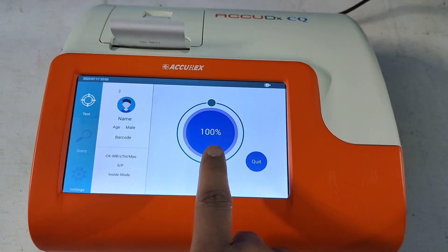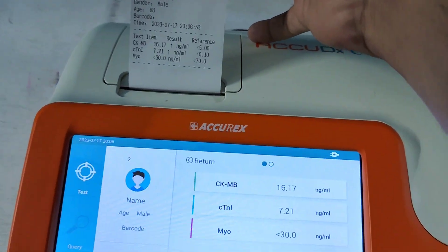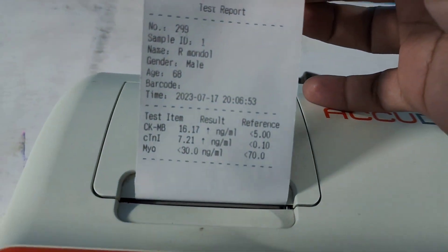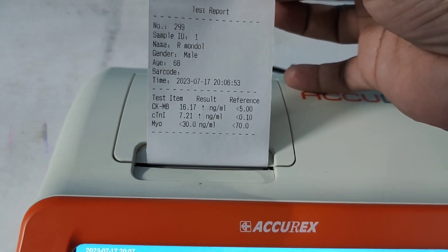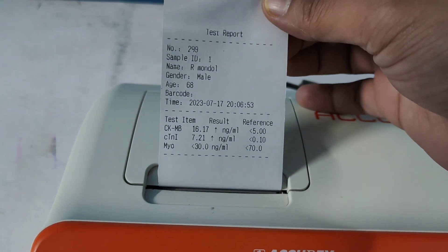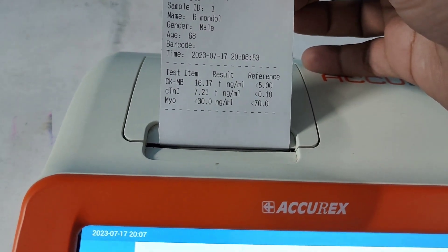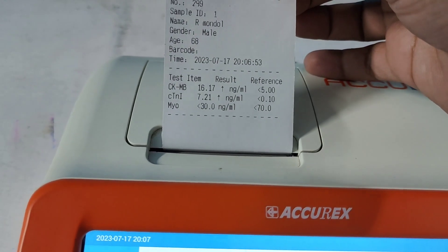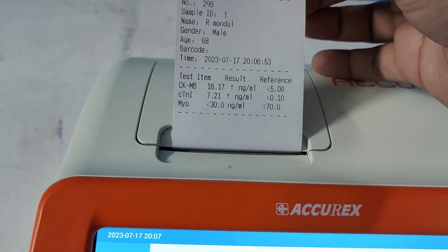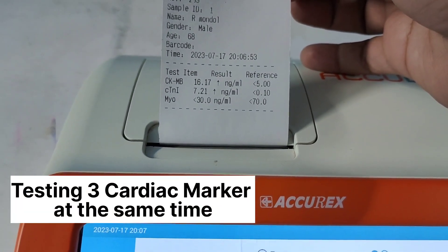100% completed — here is the result. CKMB value is 16.17 nanogram, and the reference range is less than 5. Cardiac troponin I is 7.21, and the reference range is less than 0.1. Myoglobin is in the normal range, as the reference range is less than 70.